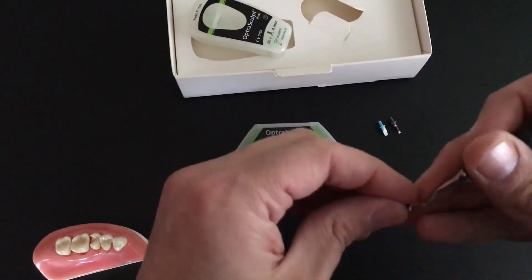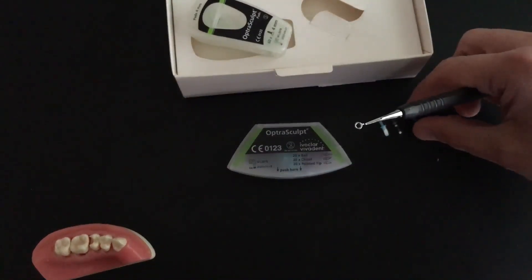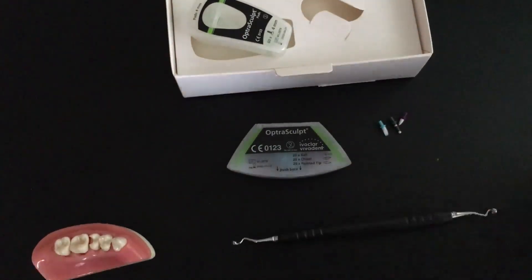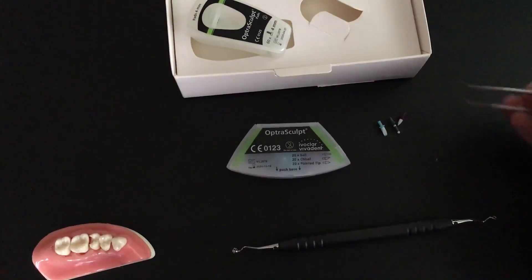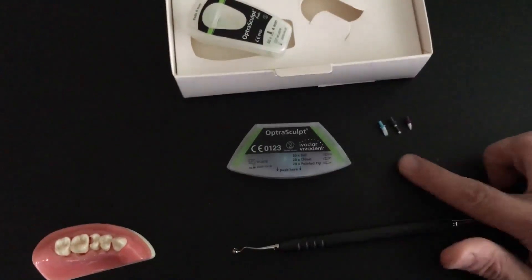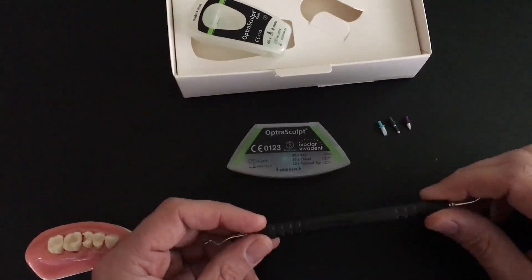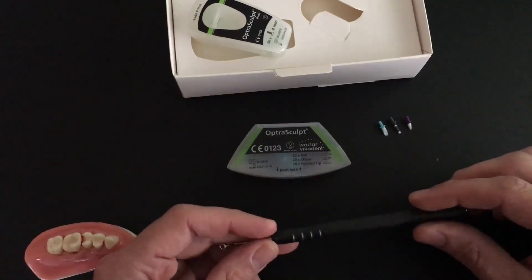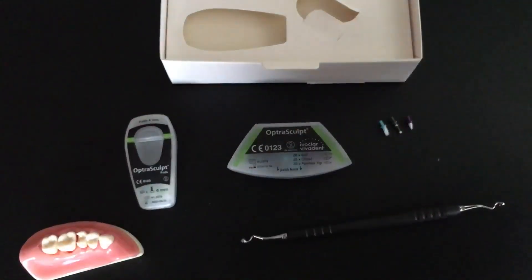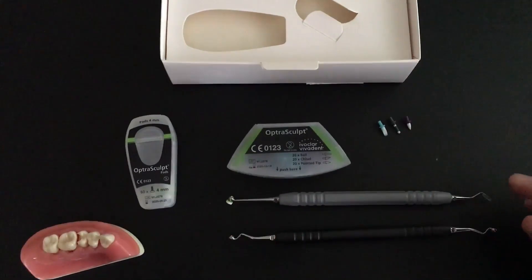They cost less than a dollar a piece — probably around 60 cents a piece. Honestly, most of the time you're probably not going to need all three of them; you're probably going to use one or two, unless you have a big composite where you're putting in a lot of anatomy. That can keep your disposable costs pretty low. I really like these OptraSculpt instruments — they work very, very well and do exactly what they say they do: they help you sculpt composites so you spend less time finishing.